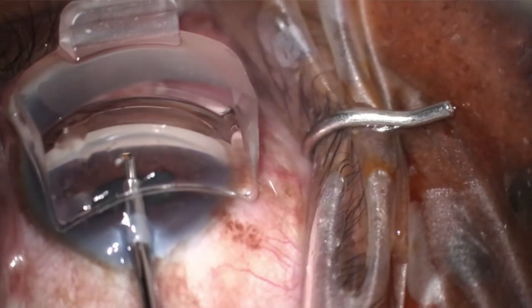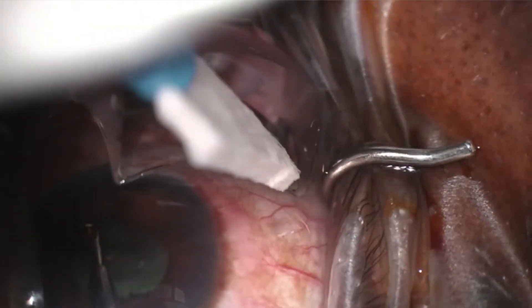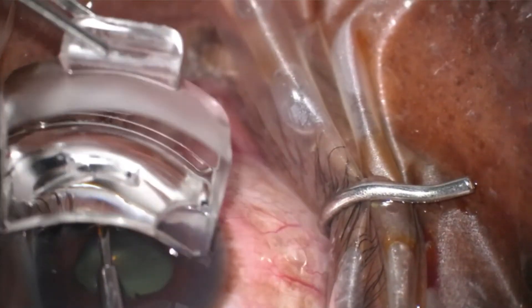Now let me share some handy tips with you. At times there may be viscoelastic or BSS that gets on the surface of the lens. Without having to hand it back to your surgical tech, you can just ask for a Weck-Cel sponge to gently clean off the surface yourself in a more efficient manner.